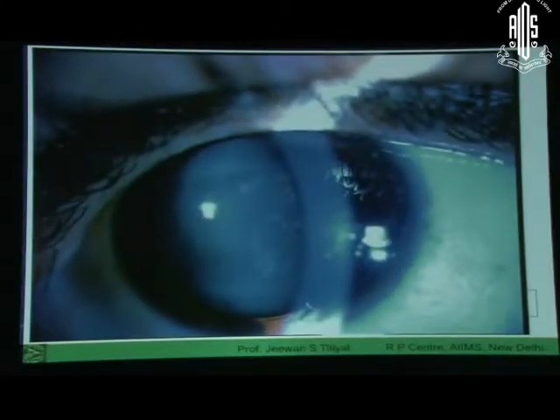But the causes can be a little bit of damage, manipulation difficulties, viscoelastic over the lens capsule, if you see in this particular case, or sometimes you do have an anterior lens capsule opacity happening because the vault is very, very less. Anything less than 100 micron or 50 micron will have a higher chance of a lens opacity coming up. So these patients should be under observation. If you feel the lenticular opacities are coming, maybe that's an indication for exchange of these lenses.